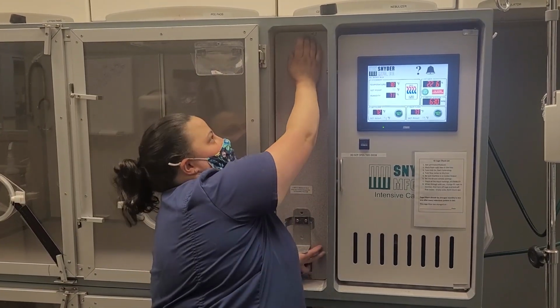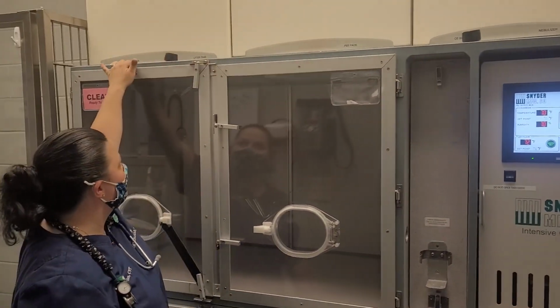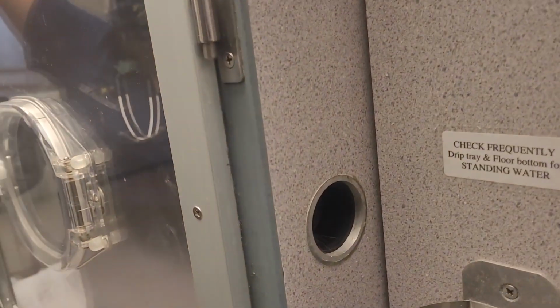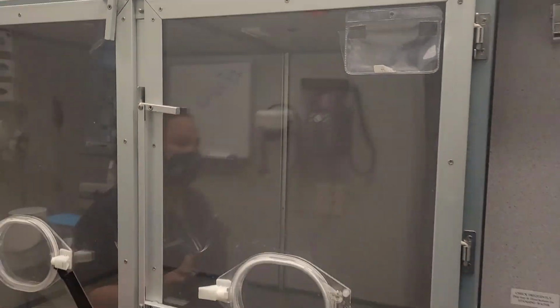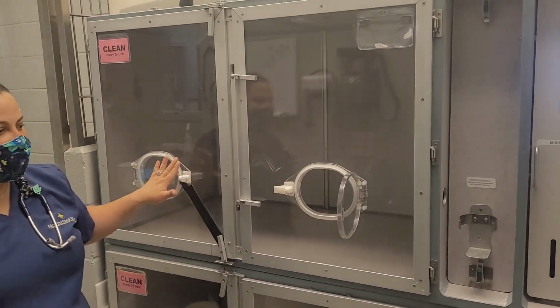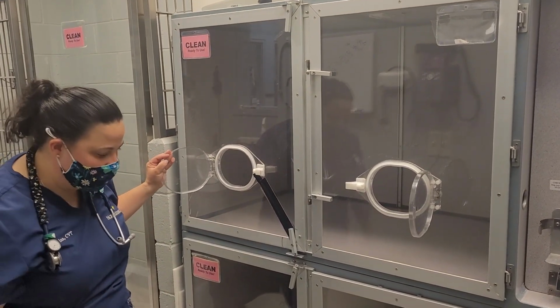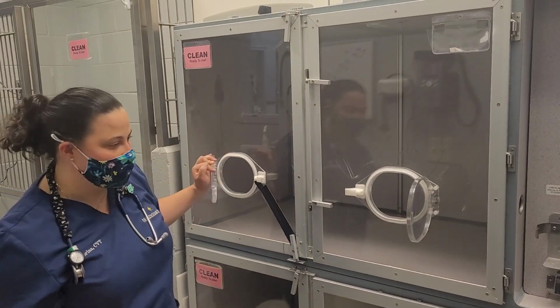Another common problem is you have to make sure all the holes of the oxygen cage are closed or sealed up. So you want to make sure that your red or black caps are on all these holes. If for some reason they're missing, you're going to have a decrease in your oxygen percentage. The other problem is your portholes. If these accidentally slip open, sometimes I do it on the bottom cages, I hit them with my leg if I'm working on the patient above, your oxygen will obviously drop.